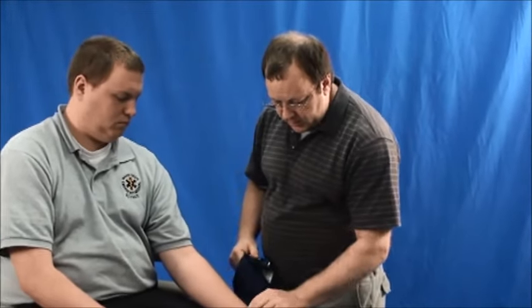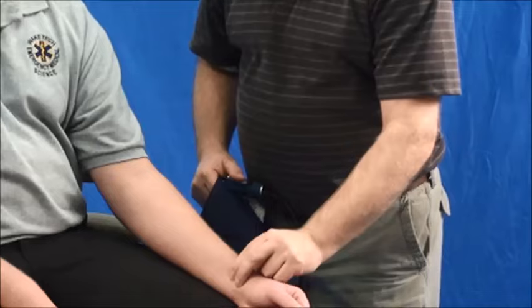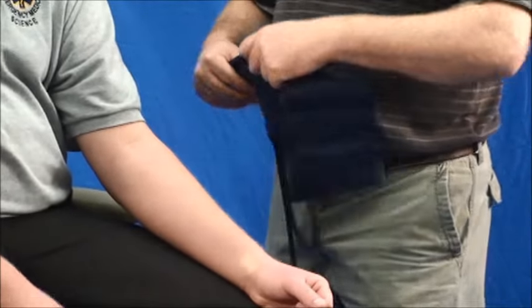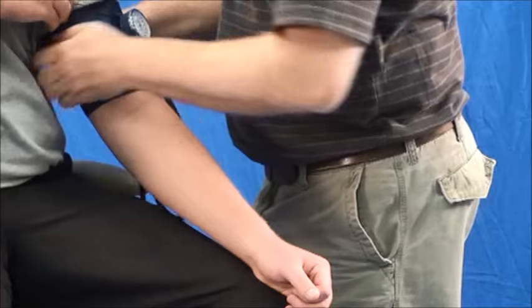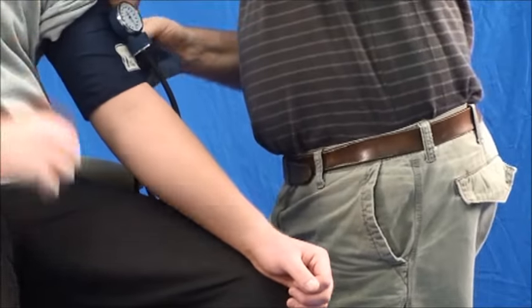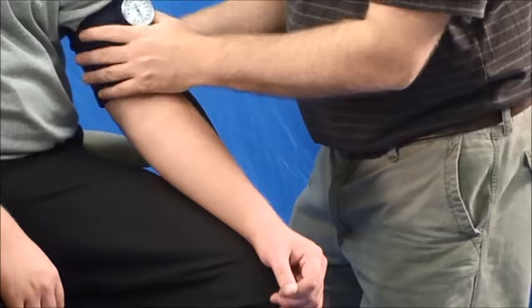First, locate the radial pulse. Make sure your patient is in a comfortable seated position. Expose the arm. Place this blood pressure cuff again over the brachial artery.